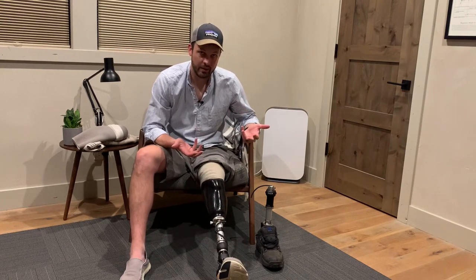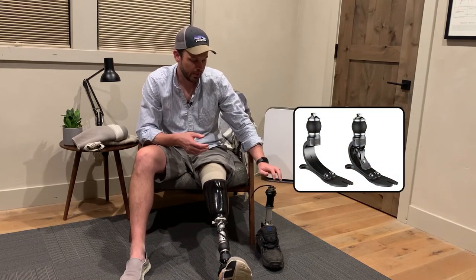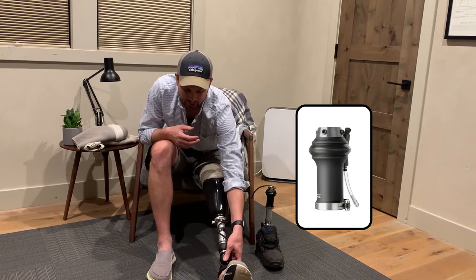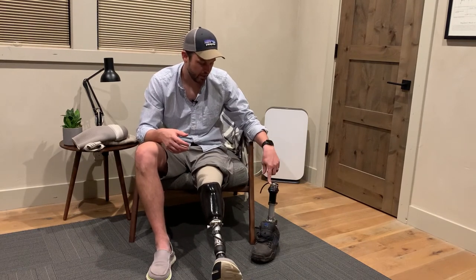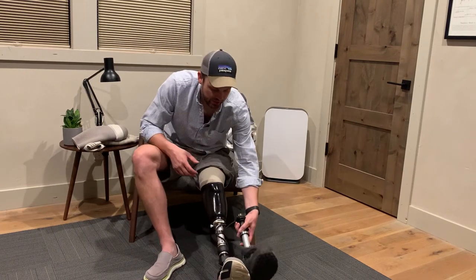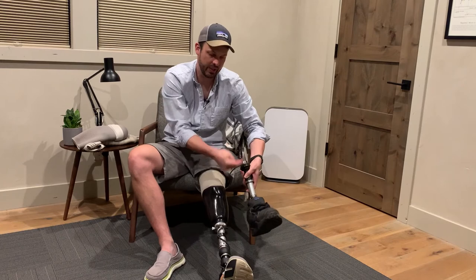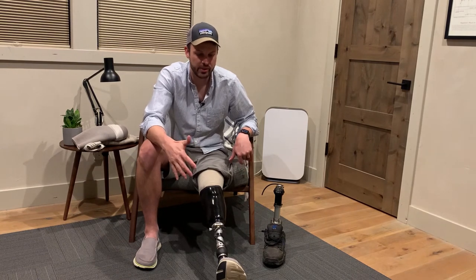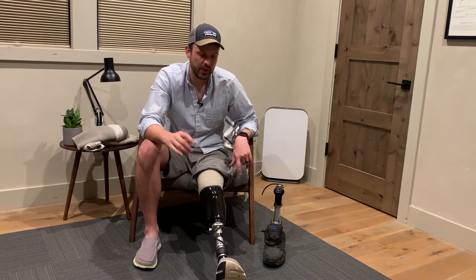Another big downside: I change feet a lot depending on activities. The most common foot I switch to for snowboarding and mountain biking is my Versa foot. Because the pump is built into my primary foot, if I take that foot off, my socket no longer has a pump. So I bought a pump off eBay, my prosthetist helped me put it on, and now when I switch feet I also have to disconnect the pump and connect it to the other foot. The pump is now built into the leg, but swapping feet a lot really complicates things with a vacuum system.